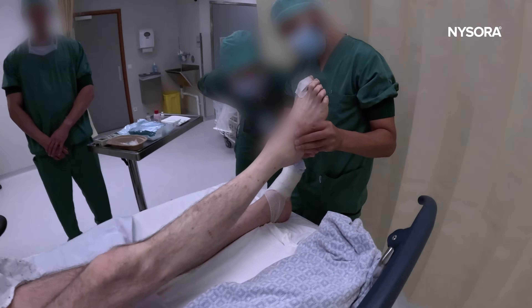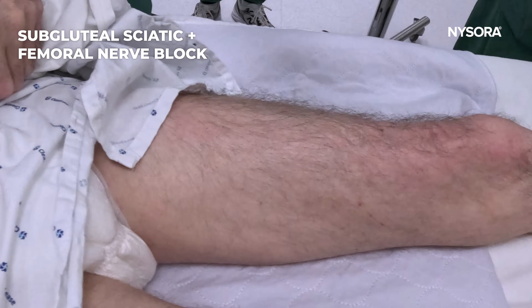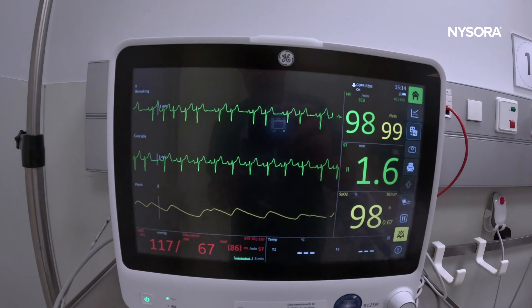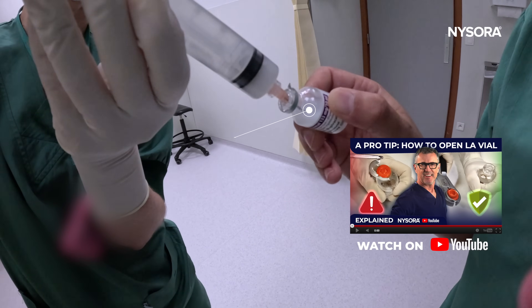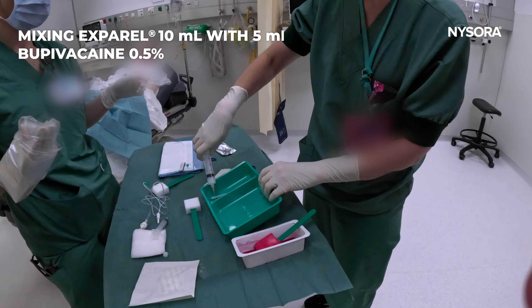Here we have a patient for leg amputation. We're going to do a subgluteal sciatic nerve and a femoral nerve block for pain. The patient presents with severe cardiac conditions and advanced age.